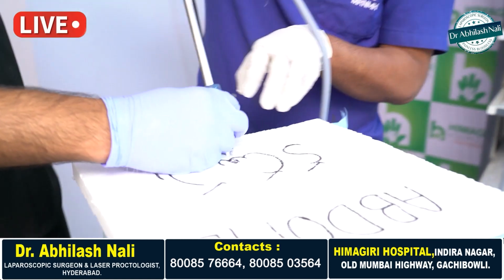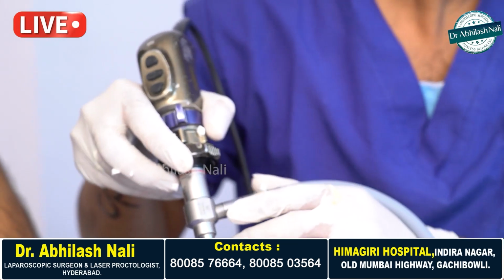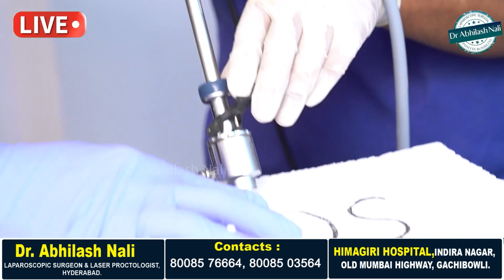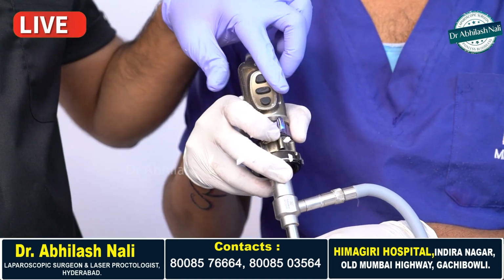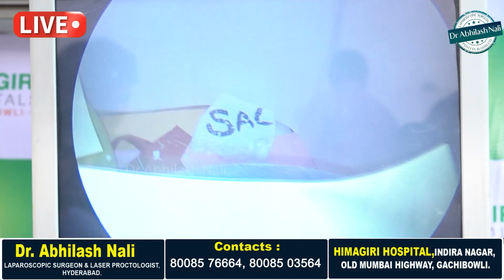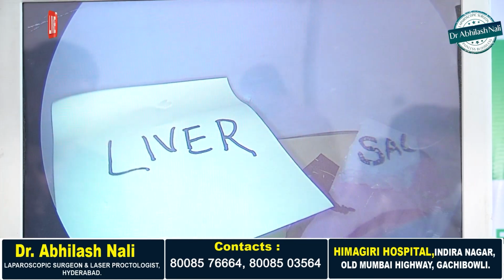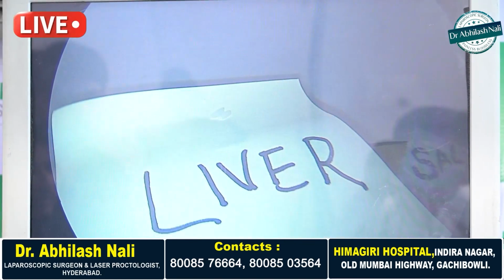So in laparoscopic surgery, this camera will be introduced into the abdomen, and it will be connected to a monitor, to demonstrate what exactly is happening inside the abdomen.